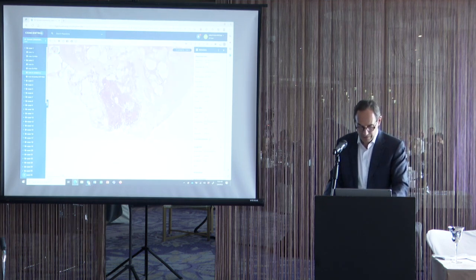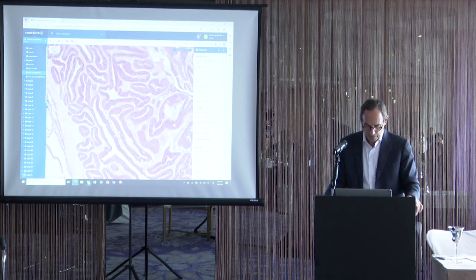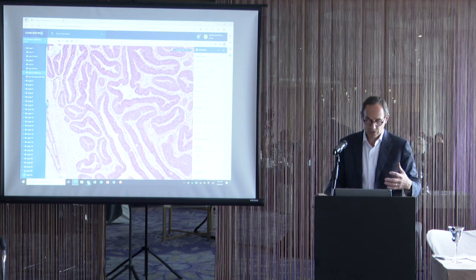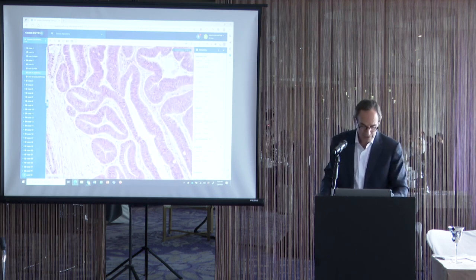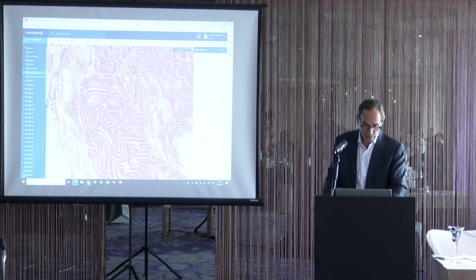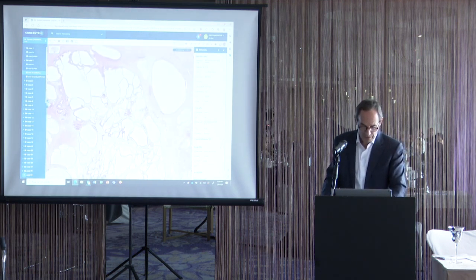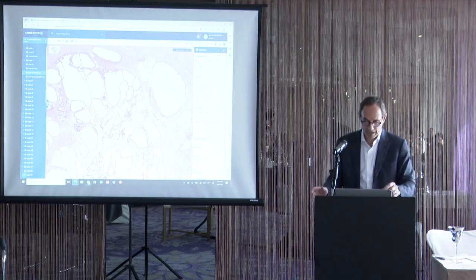This is from another case to show in a radical what it looks like. So interestingly, this radical had areas like this, where the glands look like PIN, in that usual ductal cancer is going to be papillary cribriform. These are not papillary cribriform. These are individual glands that look like PIN. And then we come over to here, we see these big cystic glands, which at low power you think, oh, that's just BPH, big cystic BPH glands.